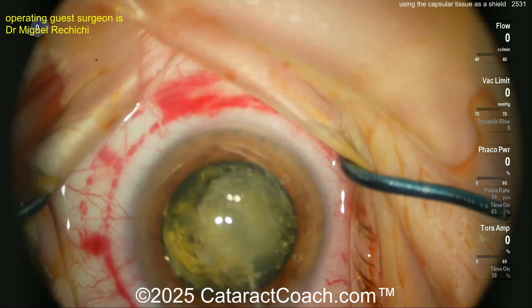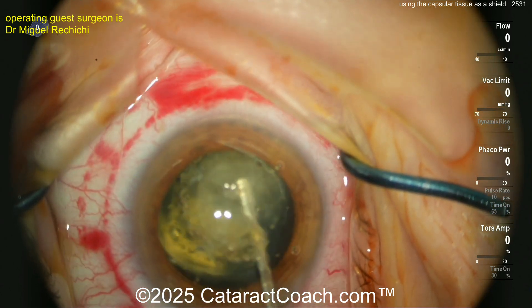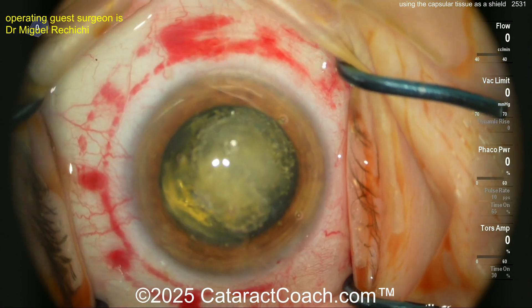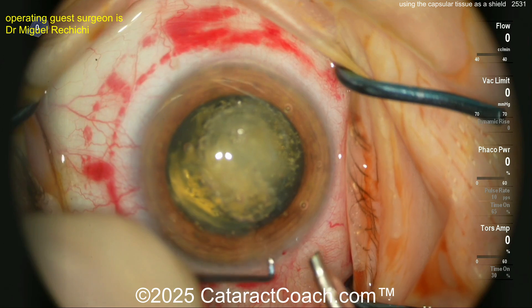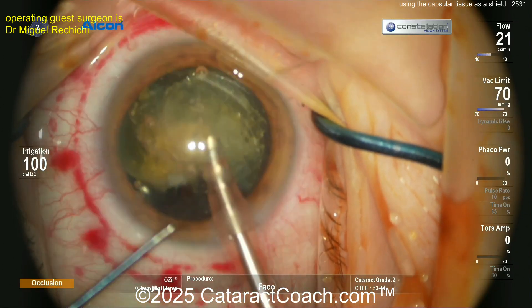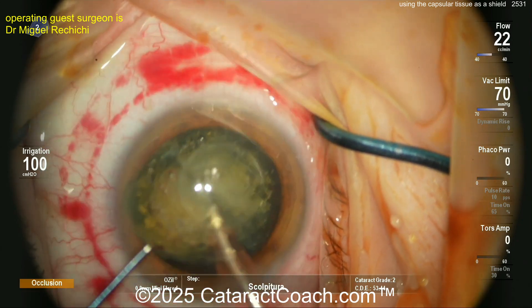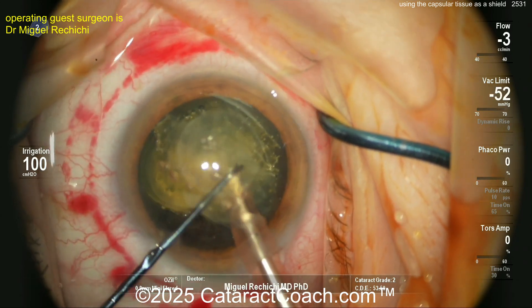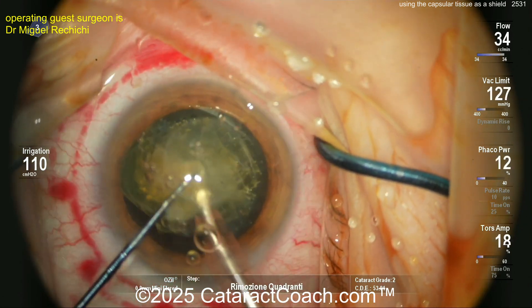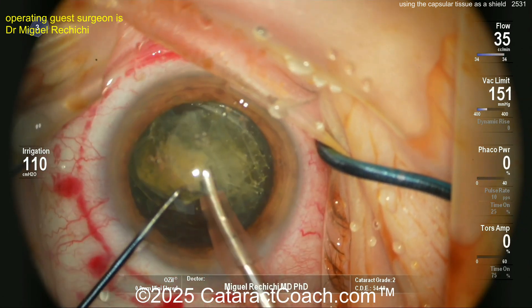If it were my eye having cataract surgery, at this point I'd rather just have a beautifully done capsulorhexis with a very talented surgeon. I don't want this 360-degree subconjunctival hemorrhage from the suction ring — I don't think there's a big benefit here. Now you can see, look under the endothelium of the cornea — there is that central button of capsular tissue right up against the endothelium.